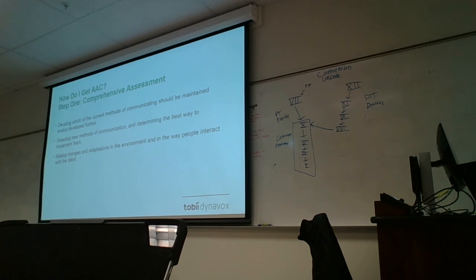A lot of times it just helps for the device. So if we're recommending a Tobii Dynavox device, then they go back to the doctor and get the prescription. Each device does have its own medical code because it is durable medical equipment. The device has its own code, and the access method as well. If eye-gaze interaction is needed, that has its own code, and the mounting option is also a different code, but everything gets put together into that packet. The paperwork is then sent to the funding department that Matt was explaining, and they put in the claim to the insurance company. But that step has to be followed.